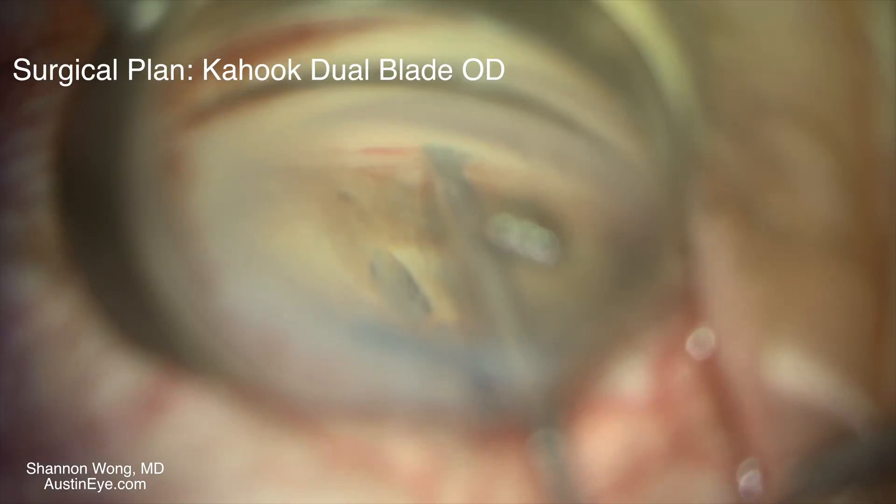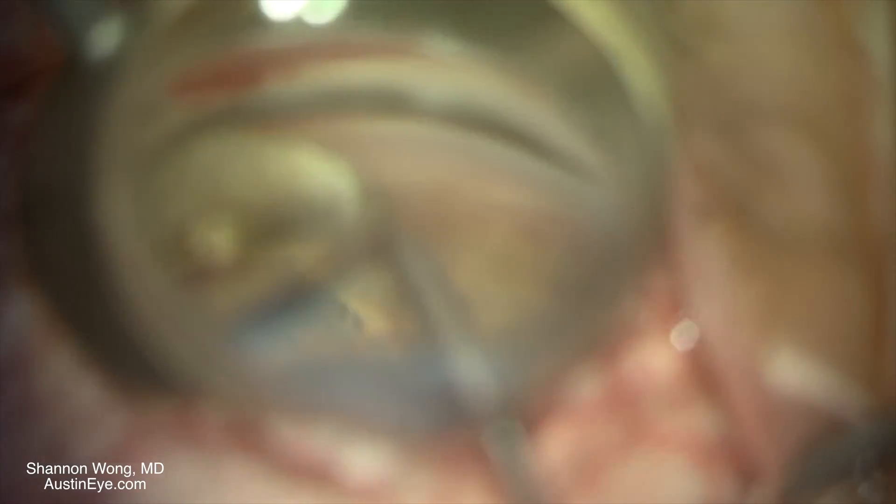We use it over about 75 to 90 degrees of the pigmented trabecular meshwork — essentially as much of the meshwork as we can see through our gonial mirror.